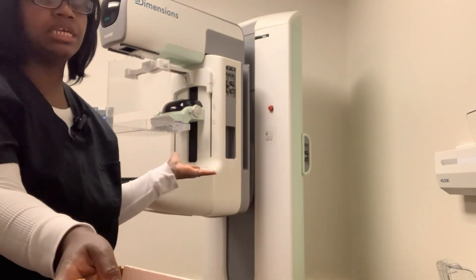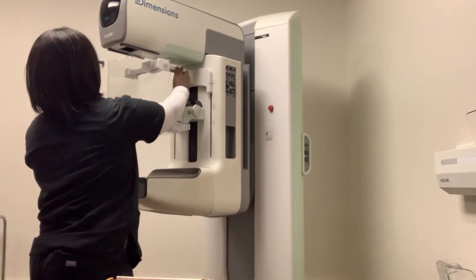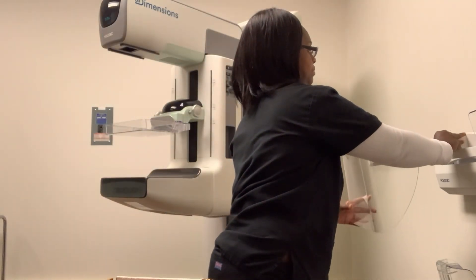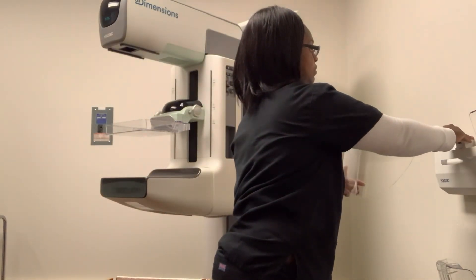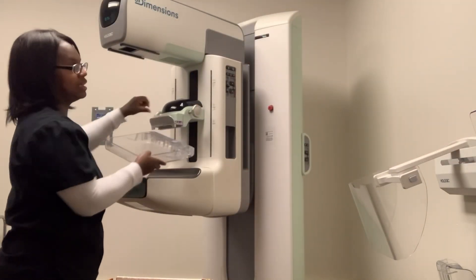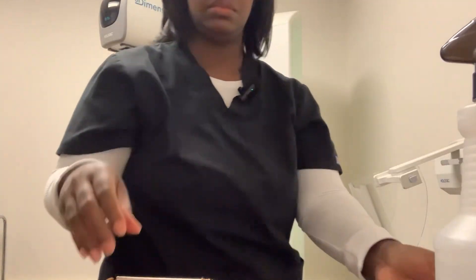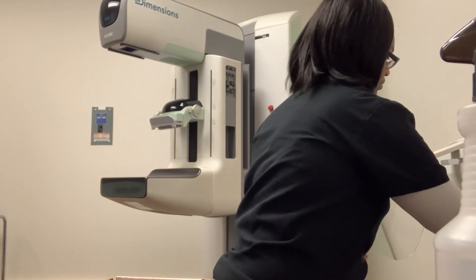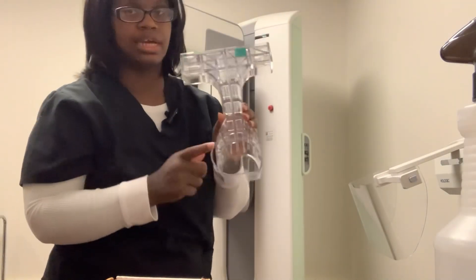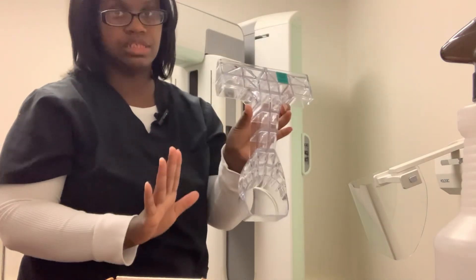Here is the Mammography Machine. Before I begin, I'm going to take out the face shield and then just hang it over here. And then I'm going to take out the paddle. The instructions say to use the QC compression paddle, but I'm going to use this one just for demonstration.